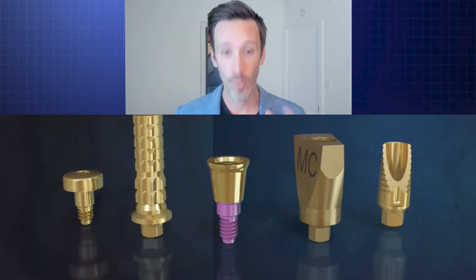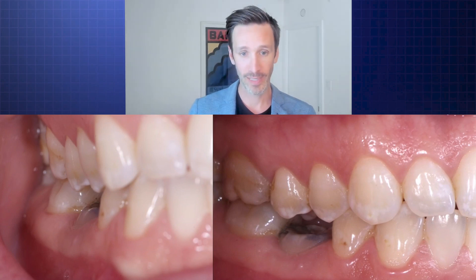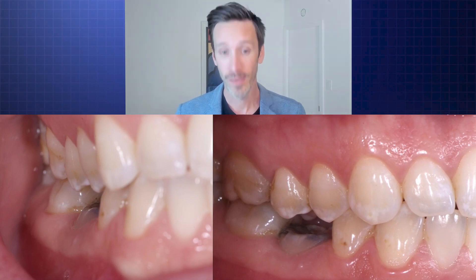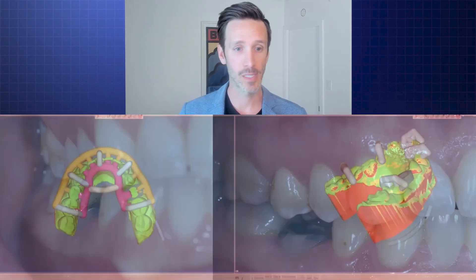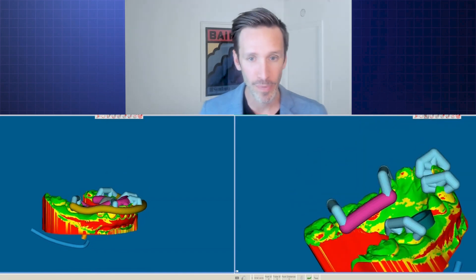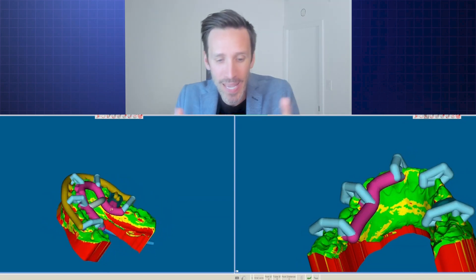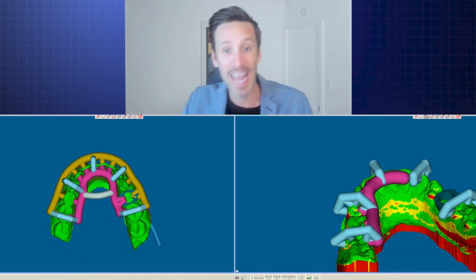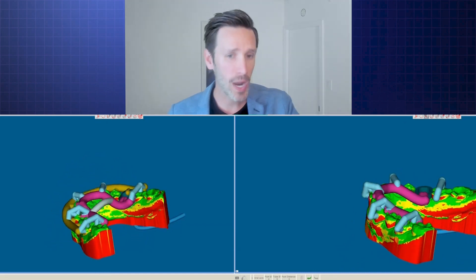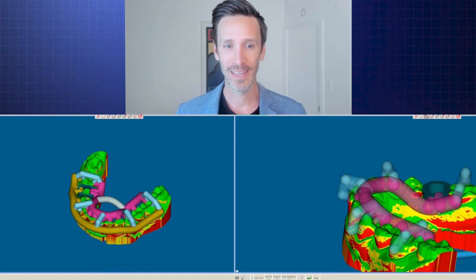Let me show you a case where we use this. This is a retained primary tooth. Why we were taking it out was aesthetics — the patient had pain on it, and we also had super-eruption of the upper tooth. Taking all that into account, we decided it was time to extract the baby tooth and proceed with treatment planning. We're going to do it with guided surgery using this open lattice type of guide from the M Guide Center. I like these types of guides because they allow me to pick the amount of undercuts I want, so that's one less hand that needs to hold the guide.